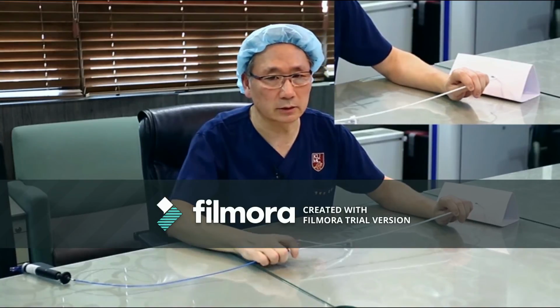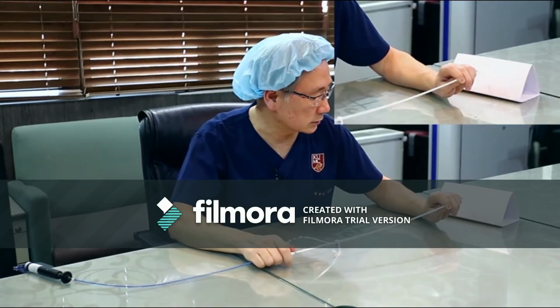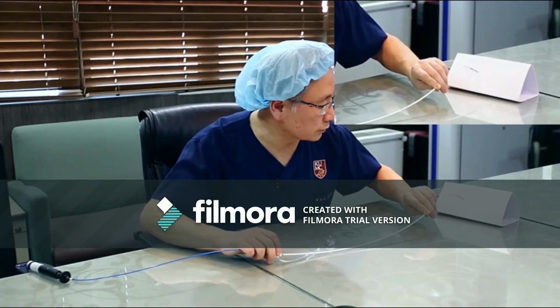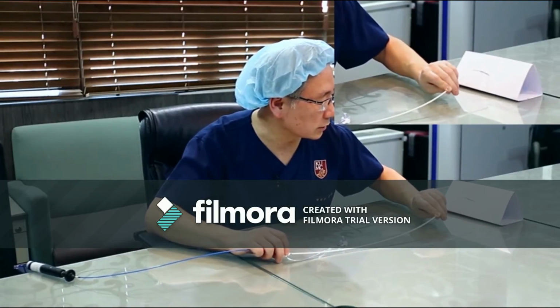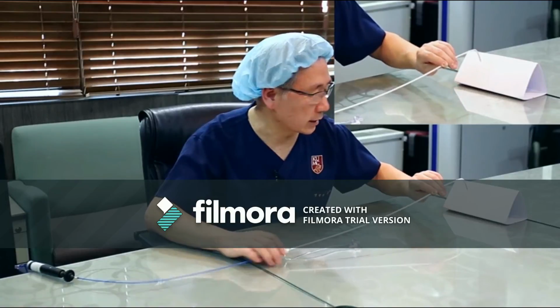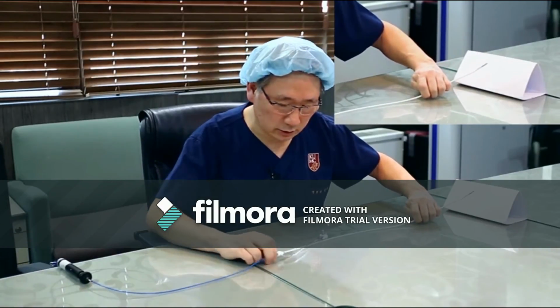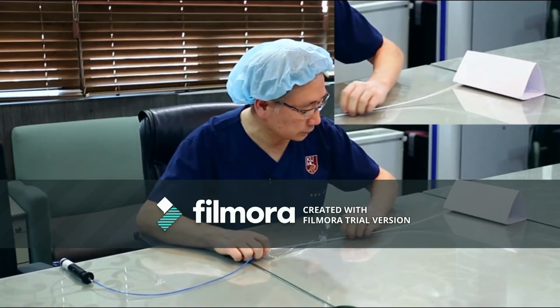You can watch the three-dimensional mapping system. So once again, the direct approach to the roof line is very unstable. So I suggest this direction, insert more.